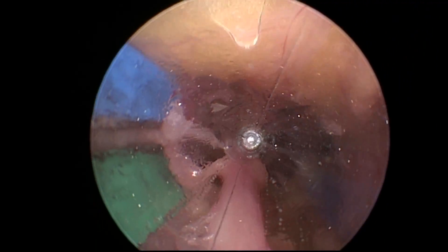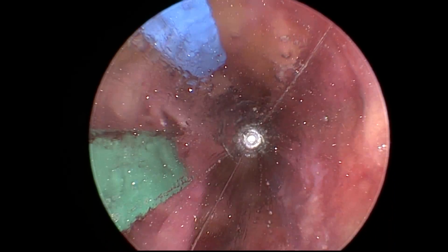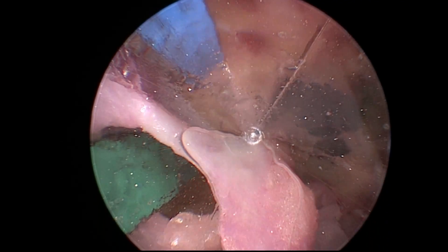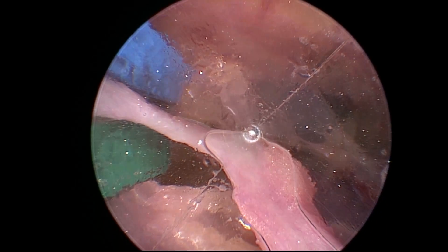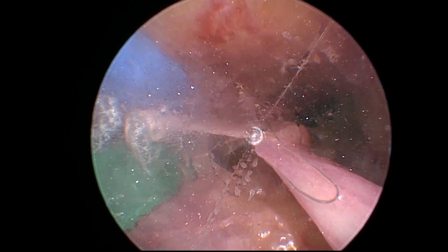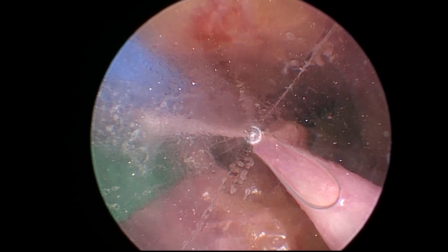Initially I'm going to show that I go across the branch and close on the branch completely and then engage the bovie and open just about a millimeter to cause some cauterization. Then I engage the bovie with the fingers open and then close, and you can see there's more spray when that happens.